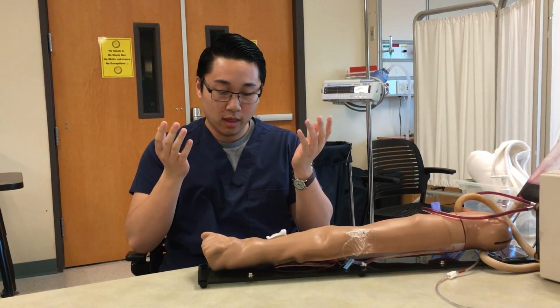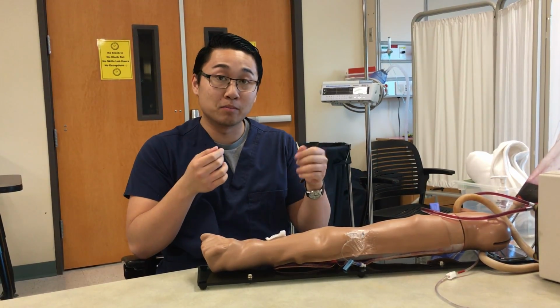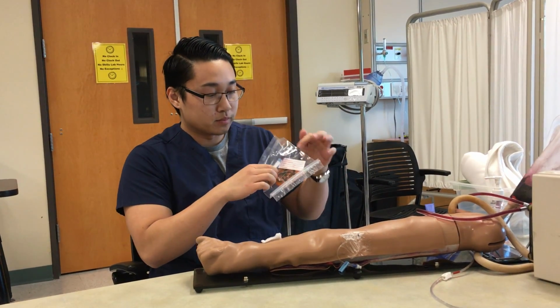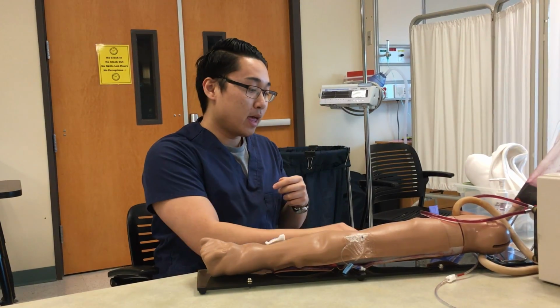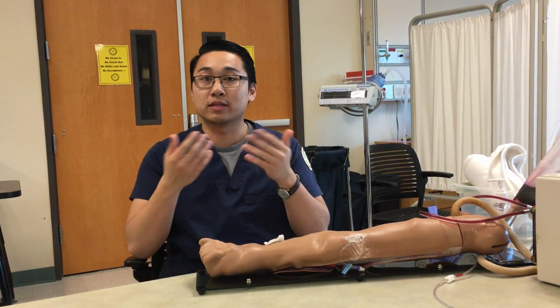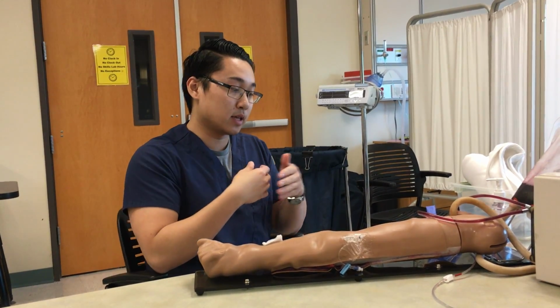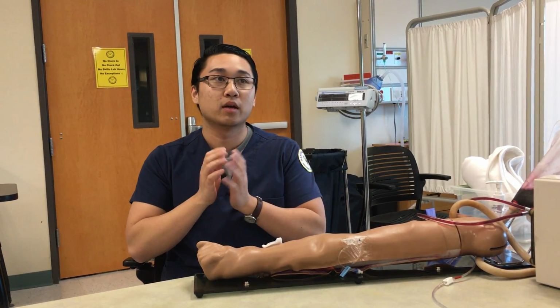For example, the arterial blood gas analyzer may need more or less blood, maybe more than 1 cc or maybe even less than 1 cc. And also, it's always nice to ask a nurse or physician if they need an arterial sample, so that could dictate you taking more or less blood from your patient.